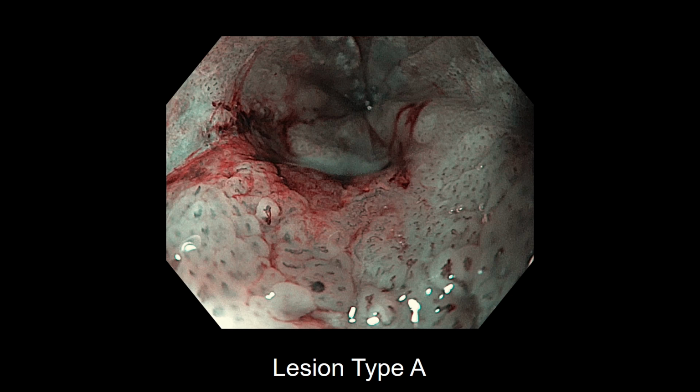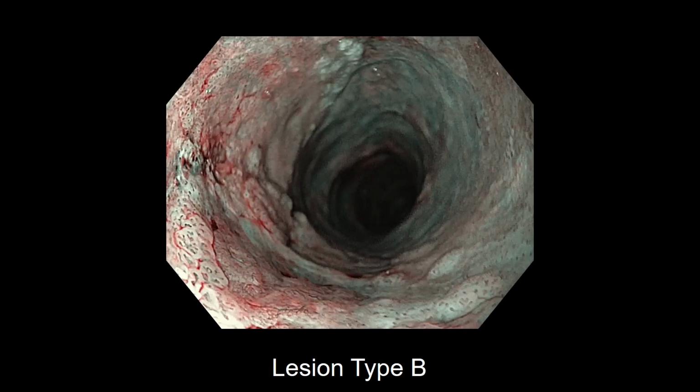Then I think this is somehow the same. It looks also still somehow regular. Yes, the IPCL are still regularly arranged, but each IPCL has already changed. This is also the finding of upward growth of the tumor, with some papillary change of the mucosal surface.